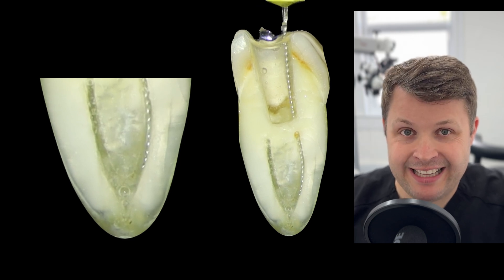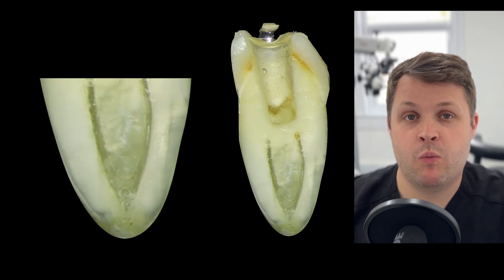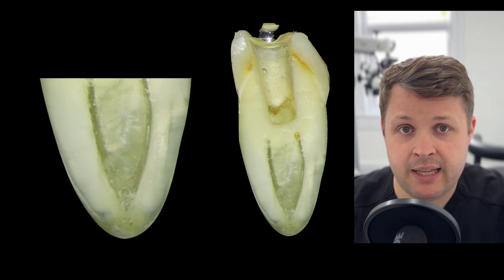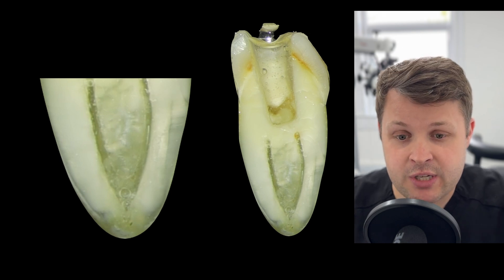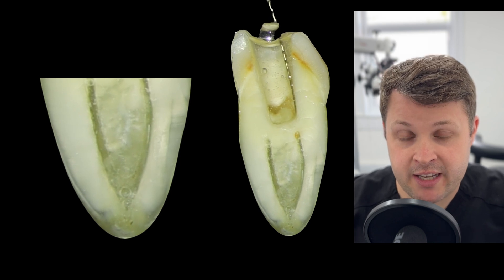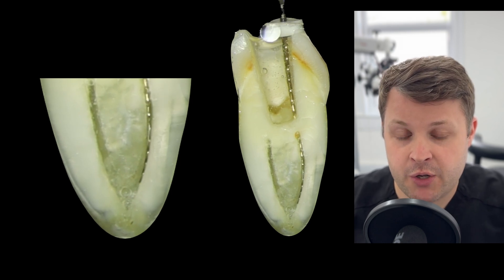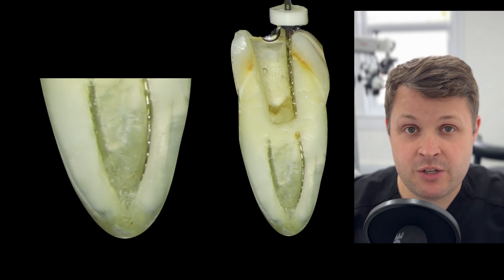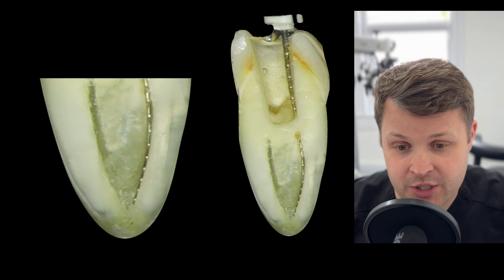The lingual canal is essentially the main canal, so that's the one we'll shape first and forget about the buccal for now. Now I'm going to use a glide path file to automate the opening of the canal space — I'm using a Tooth Saver 1403 glide path file — but this is getting stuck. The worst thing you can do is push this further, as you'll cause a file fracture.